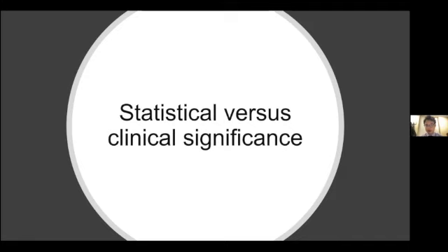So thinking about the particular clinical context and the use cases is absolutely vital to trying to make any of these algorithms work. While a lot of the models have very high performance, the question now is the implementation gap of going from high performance models to clinically useful models: identifying that clinical context and seeing how it can fit.